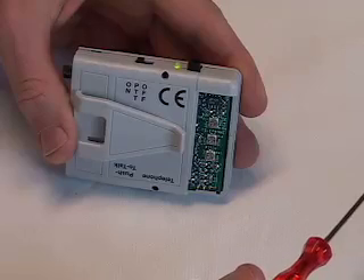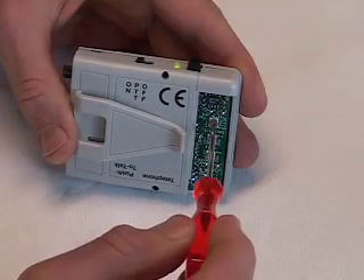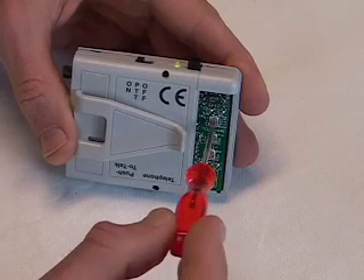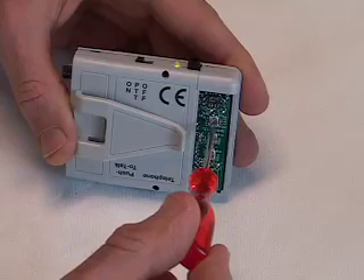You'll find two other controls behind this sliding panel. The top control is the microphone gain. Adjusting the microphone gain enables you to use different microphones — for example, you might turn down the gain with a throat microphone, but turn up the gain with a lapel microphone.